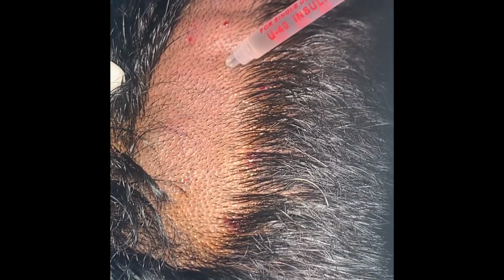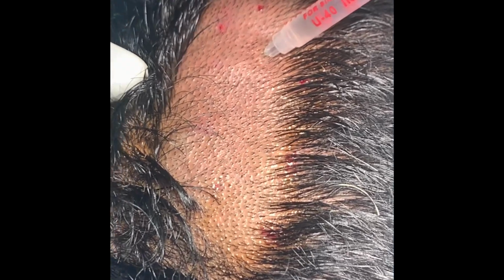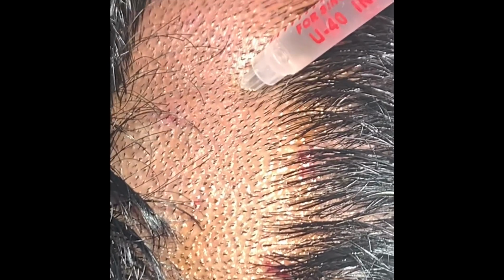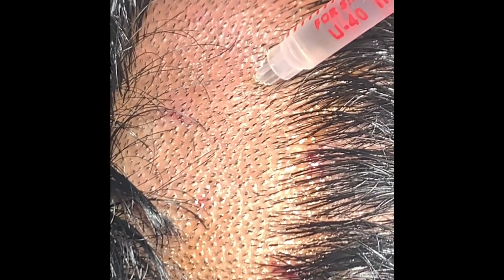So we've prepared a very small area for this patient because we just need less than 200 follicles for the mustache. And using a diabetic syringe so that the pain is going to be minimal for the patient, already given a block.